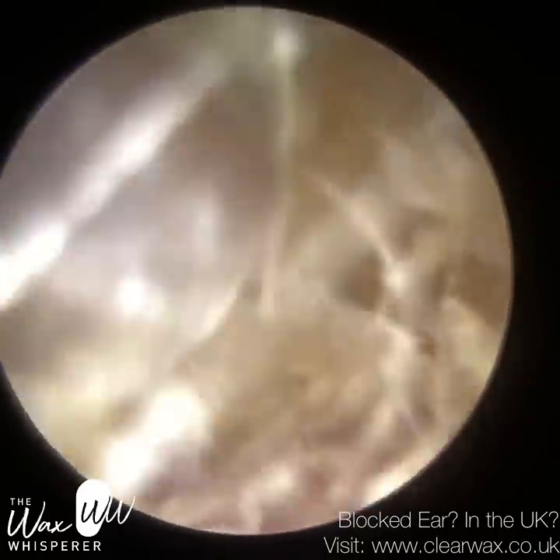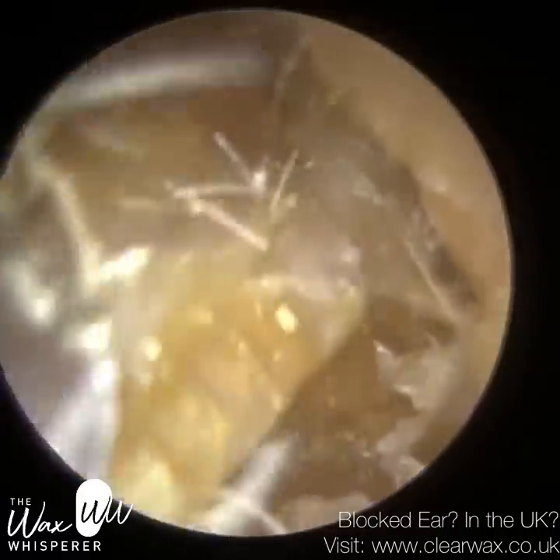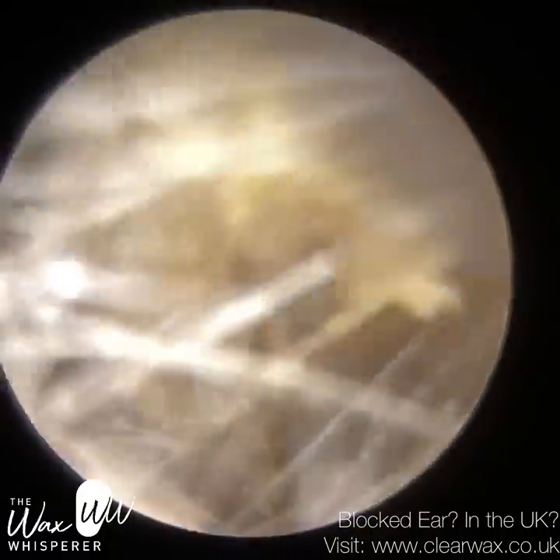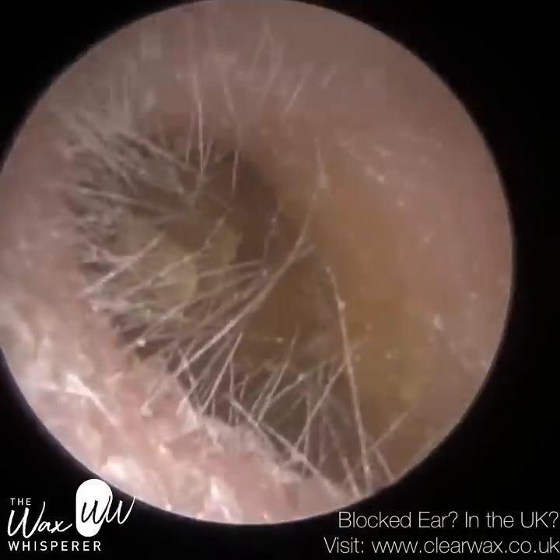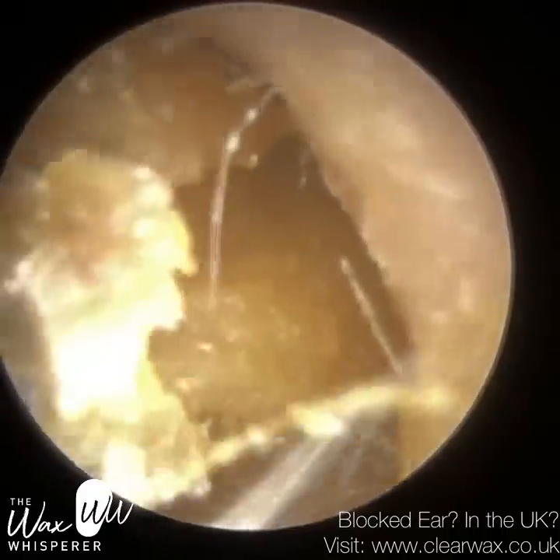Because of the consistency, it's causing the inside of the suction probe to get blocked as the wax is suctioned up — it's clinging and sticking inside the probe. In a moment I'm going to instill some medical grade olive oil spray to help lubricate the inside of the suction probe.